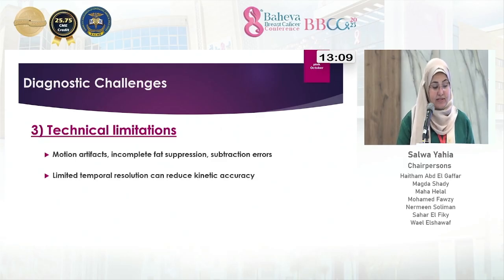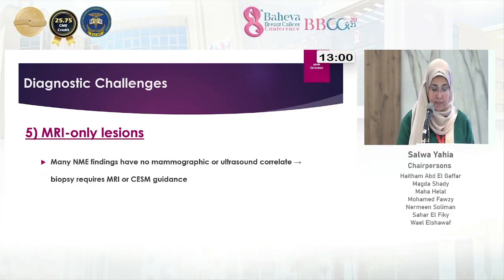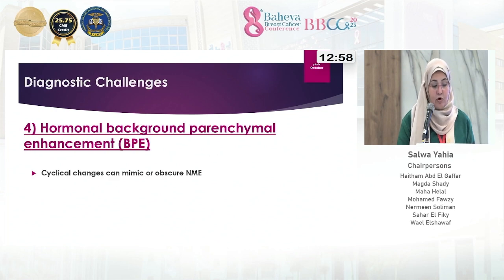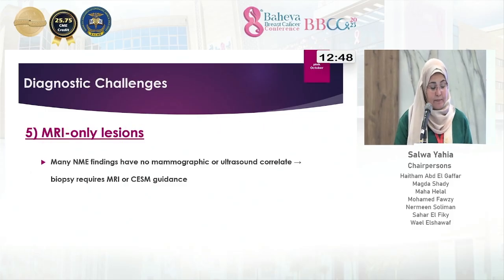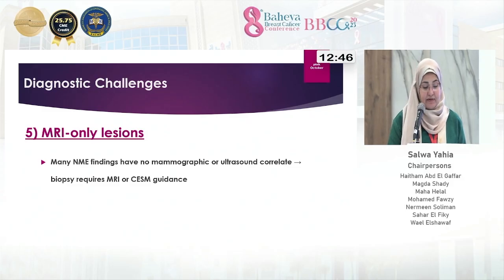Technical limitations such as motion artifact, incomplete fat suppression, subtraction errors, limited temporal resolution can reduce kinetic accuracy. Hormonal background parenchymal enhancement, like cyclic changes, can mimic and obscure non-mass enhancement. MR-only lesions: many non-mass enhancement findings have no mammographic or ultrasound correlate, so biopsy requires MR or contrast enhanced mammography guidance.